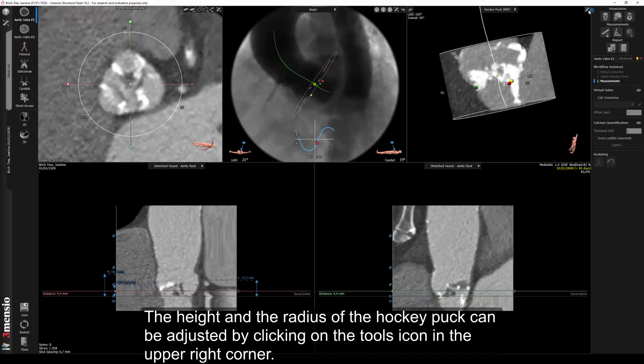The height and the radius of the hockey puck can be adjusted by clicking on the tools icon in the upper right corner.